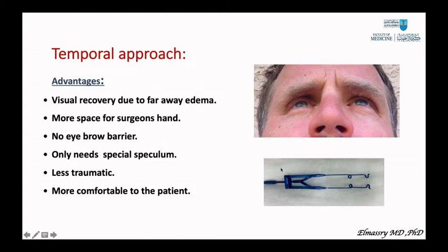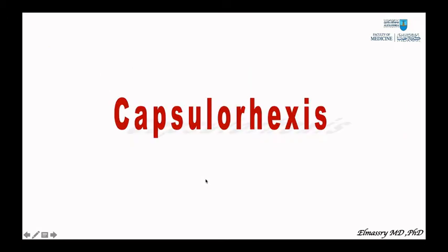And it only needs a special speculum that allows the phaco handpiece to pass through the temporal approach, and it is less traumatic to the eye and more comfortable to the patient.